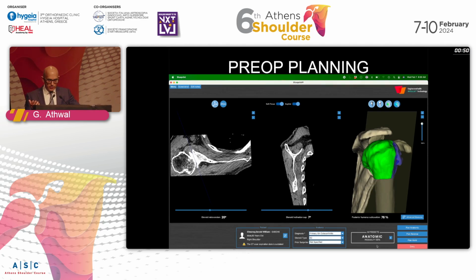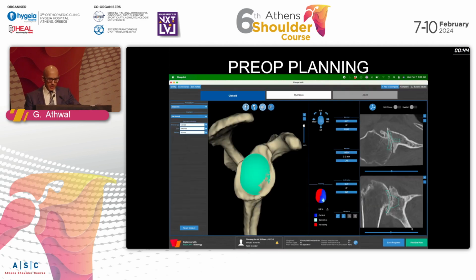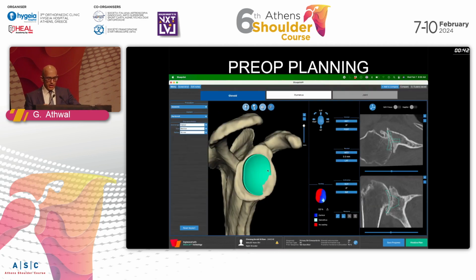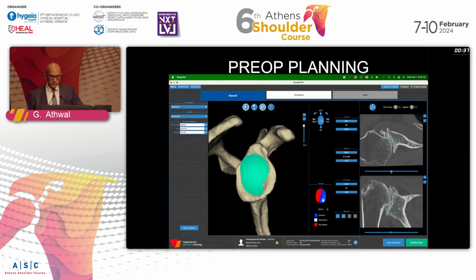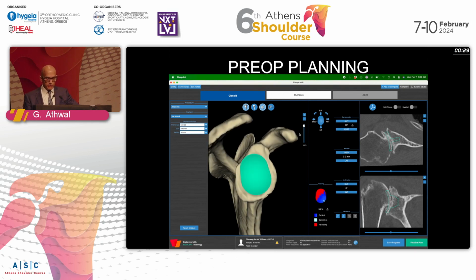In this patient, if you look at the AI algorithm, it predicts an anatomic at 55%. So it's reasonable, there is some controversy here. So let's go ahead and plan the glenoid. If I had only a standard glenoid implant, I don't believe I'll be able to correct this deformity to under 5 degrees, or under 10 degrees, maybe your number. Here, if I have to put this in where it lies, it's going to be 15 degrees retroverted, which for me is unacceptable.